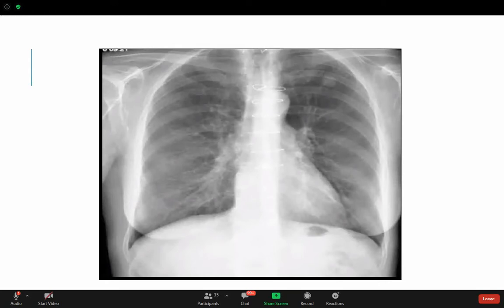Always be more specific, guys. Someone mentioning nodules. Okay, where are the nodules?